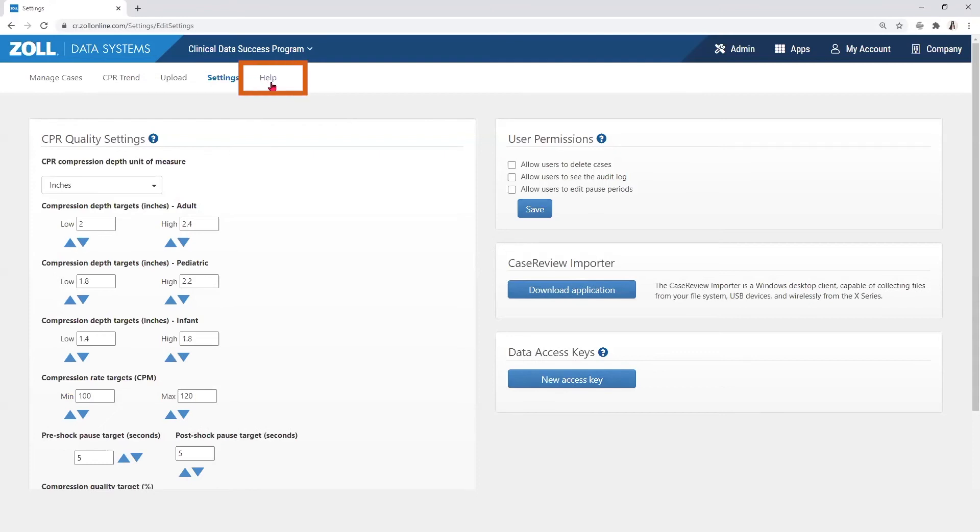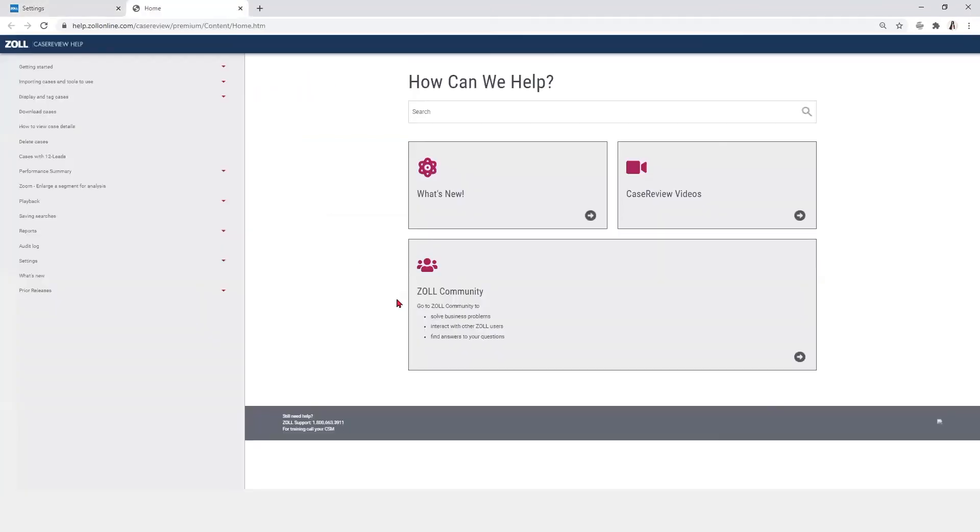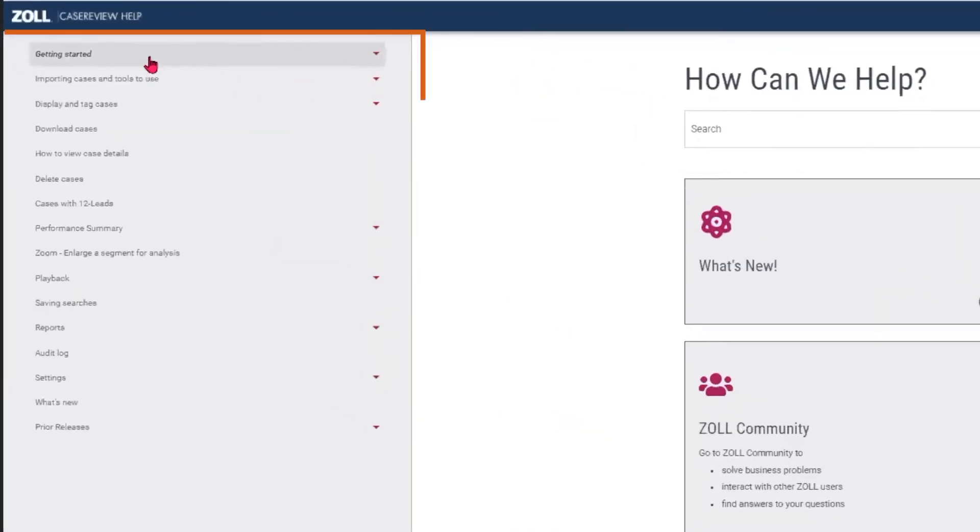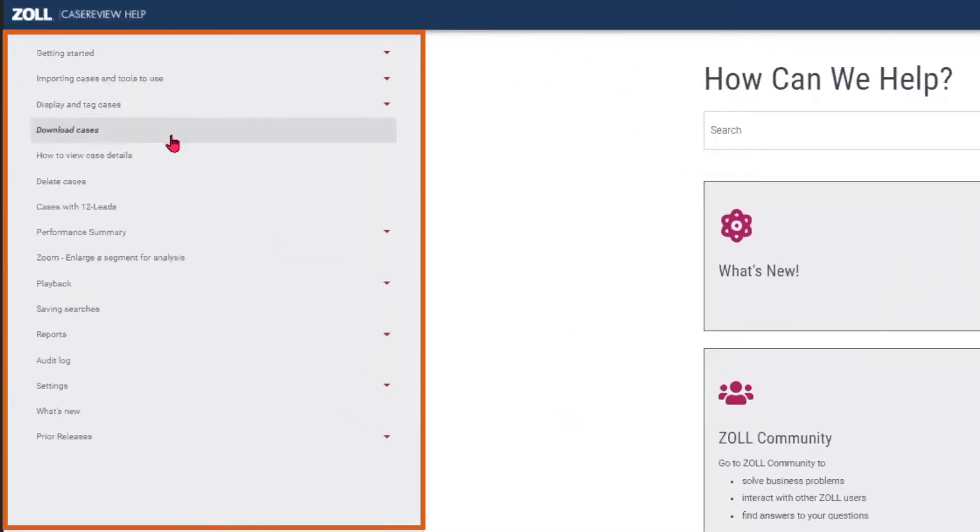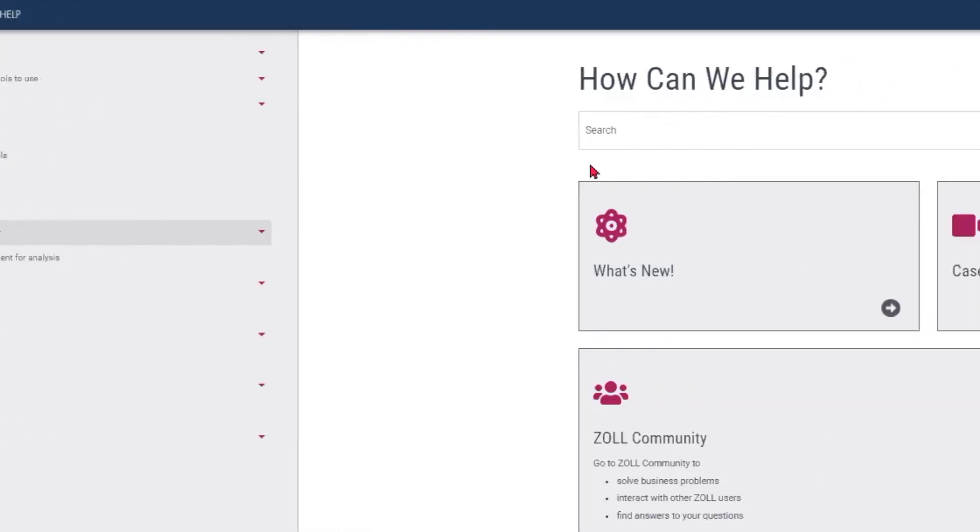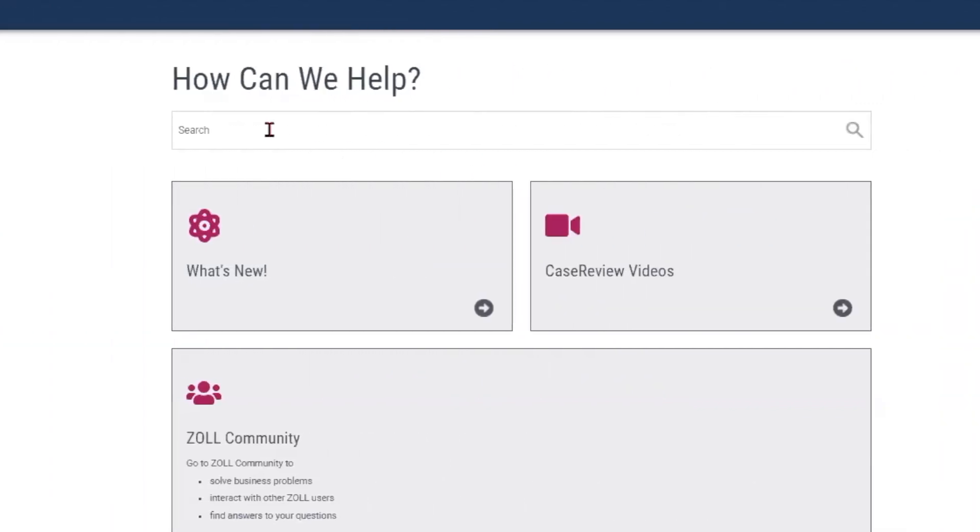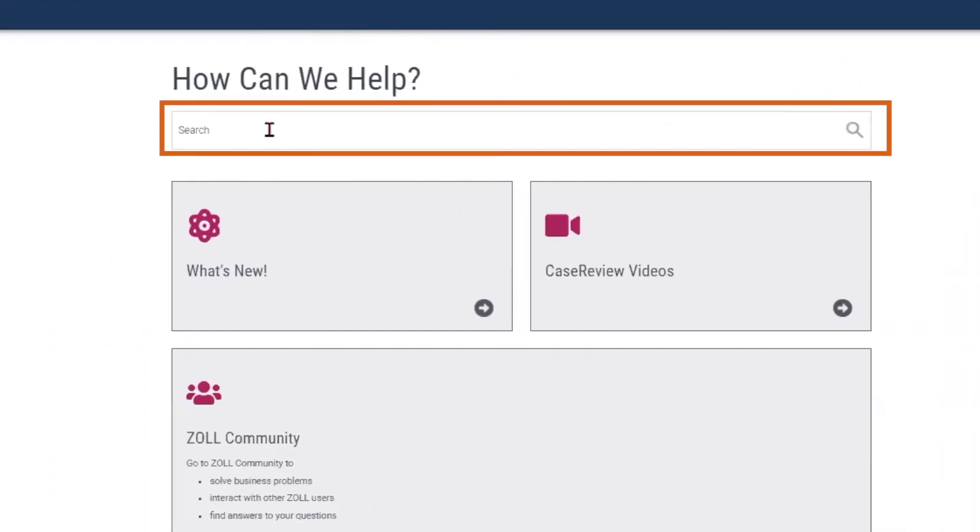The help page includes user help for all features in Case Review. They are shown in a drop-down menu to the left, or they can be searched for in the search feature.